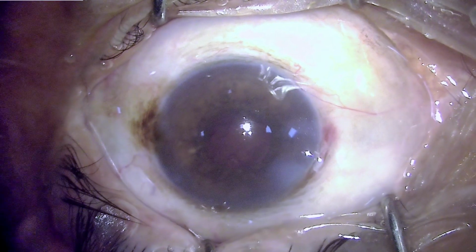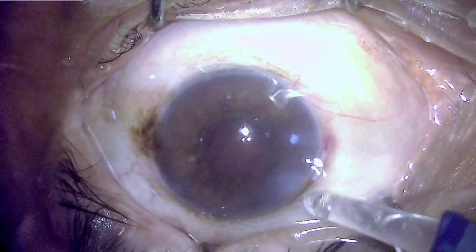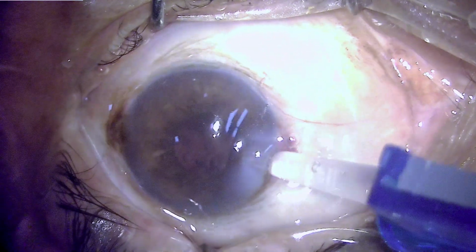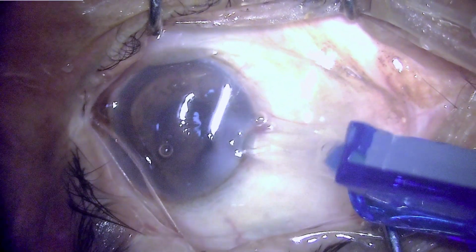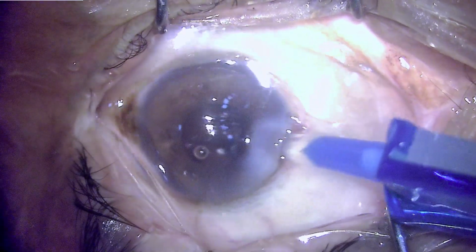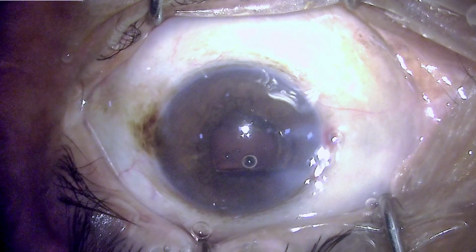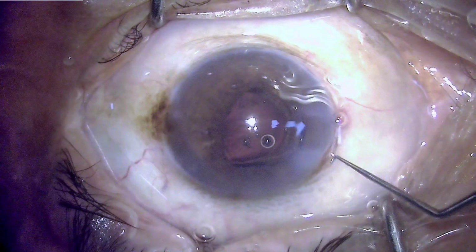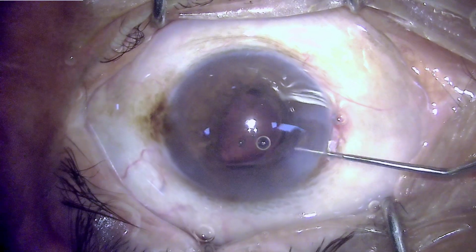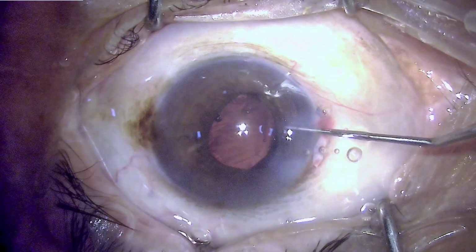Now we are ready for implanting the intraocular lens, and I must inform that this is a single piece hydrophobic monofocal IOL from Appasamy Associates, and this machine also is from Appasamy Associates, and this is the Turbo Orbit machine which has the capability for posterior and anterior segment surgeries.